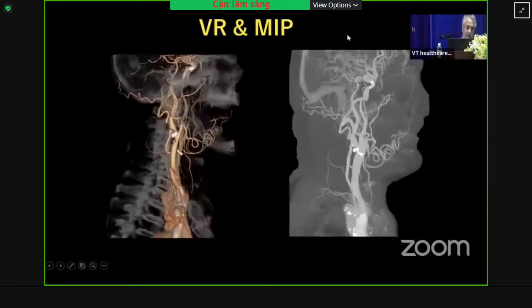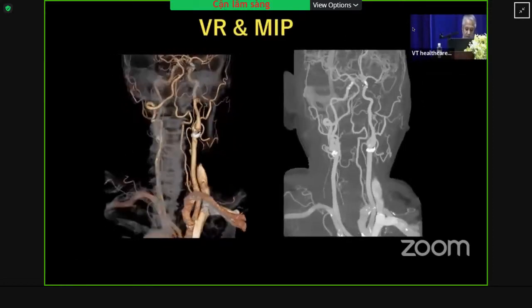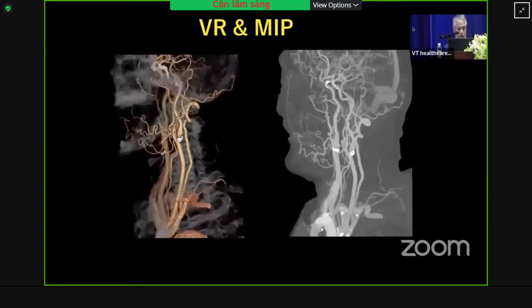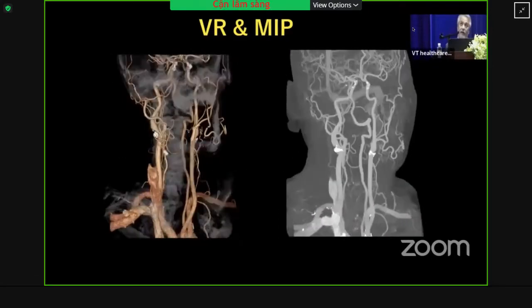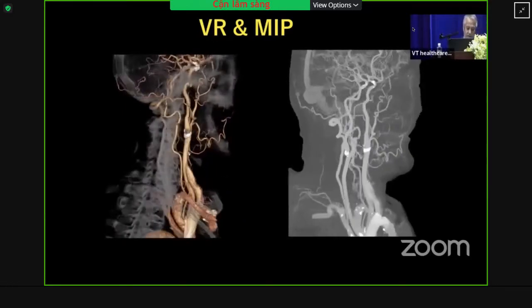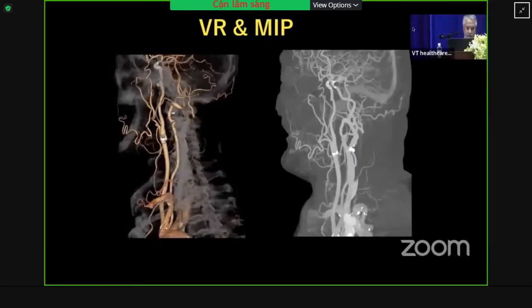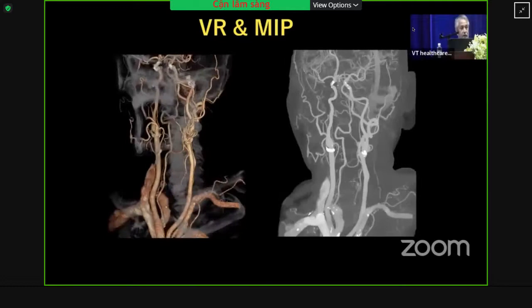A volume rendering is a virtual screen display method that makes use of space, and you can understand the three-dimensional effect and depth. MIP with the same data shows that there is no stereoscopic effect because the substance with high CT value is displayed on the projection screen.